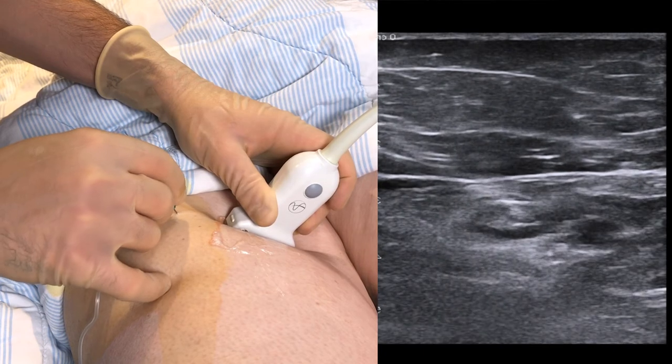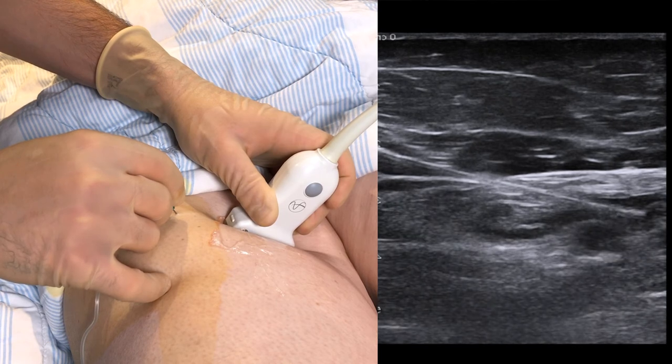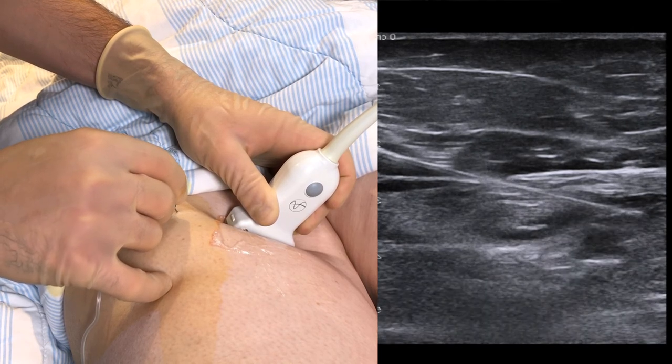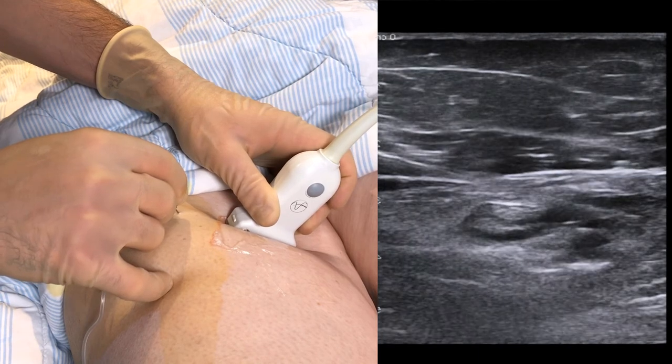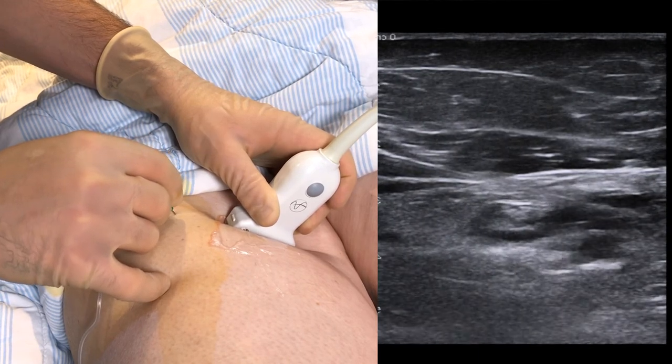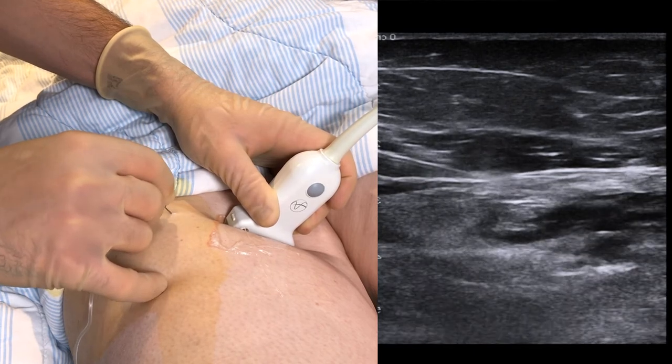In the case that we filmed here, you can actually see that some went above the fascia, but by using the in-plane technique, we could see this and compensate by going slightly deeper. You can now see how the artery is evenly surrounded by a sufficient amount, which achieved a good block.